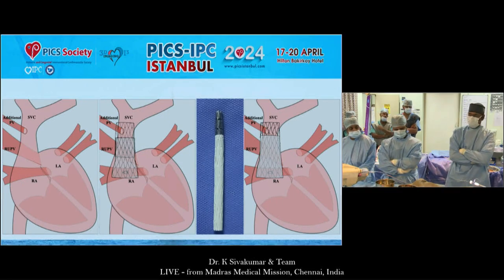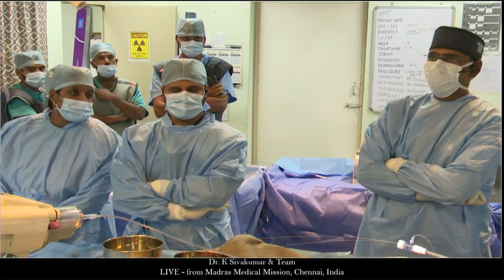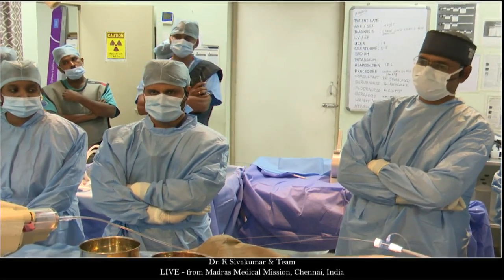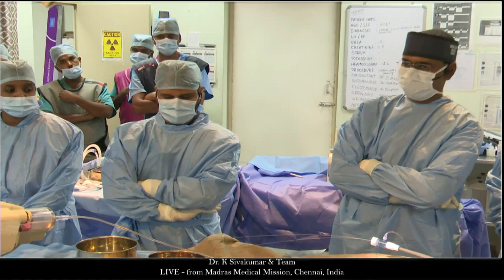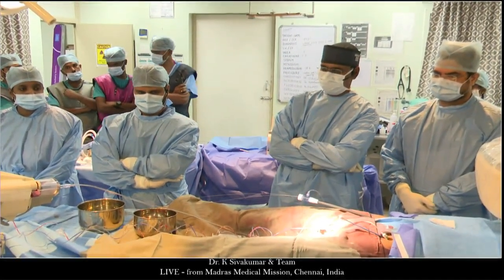Great case. Excellent. So, Sivakumar, I'm going to open this case for discussion. On the panel here, Alpai, in your center, would you do this transcatheter or surgical because of this additional anomalous vein?